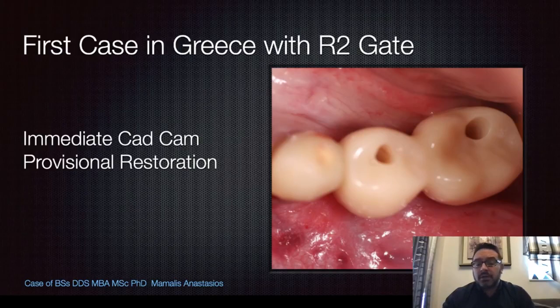It's an open software. It can export STL files that can be printed everywhere, but we print all the surgical guides in our R2 center, R2 lab, Dr. Michalis Papastamos, Dental Aesthetic Lab, because we want to control the quality and the accuracy of the guides, but they can use any dental lab that they want to make the provisionals. We can just send them the STL files that are exported from the R2ware, and make the provisionals there.